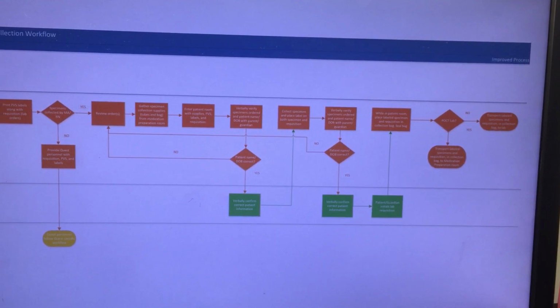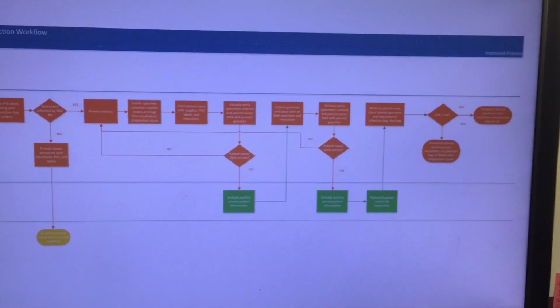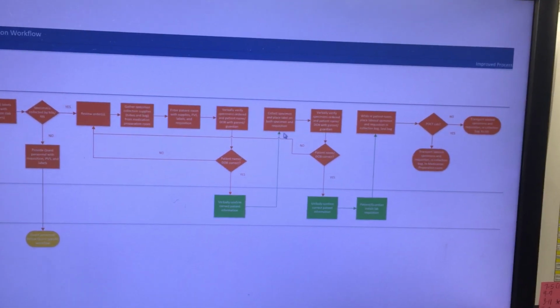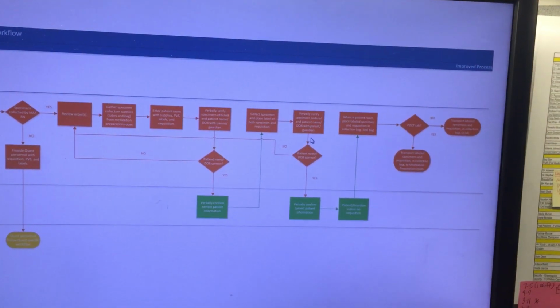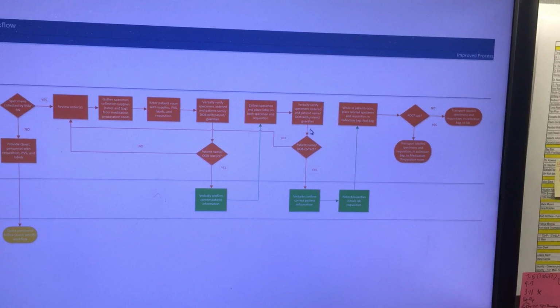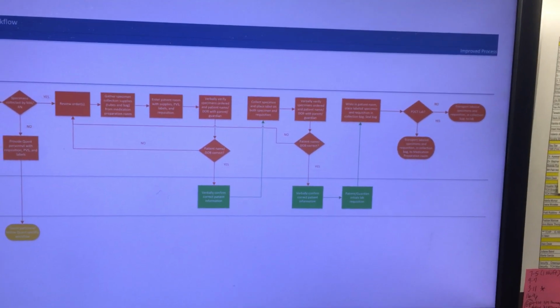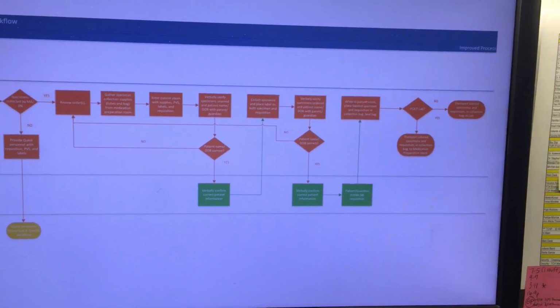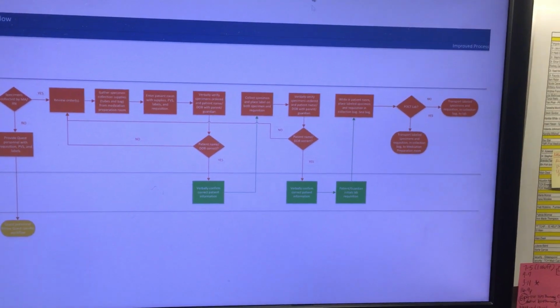That's a double verification process. You go ahead and proceed to collect the specimen. You place the label on. You say, okay, this is the labs we've collected. Can you take a look at this specimen? Make sure this label has the correct name and date of birth. We're at this step here.